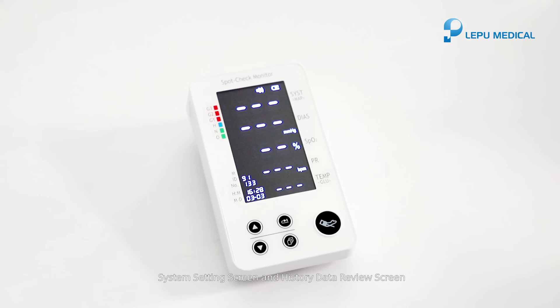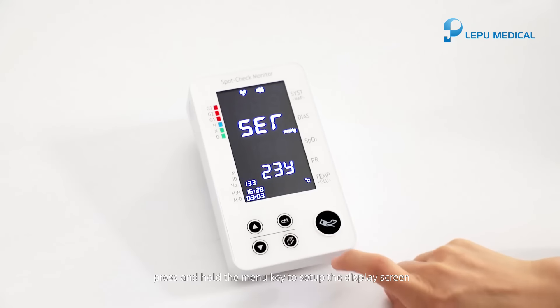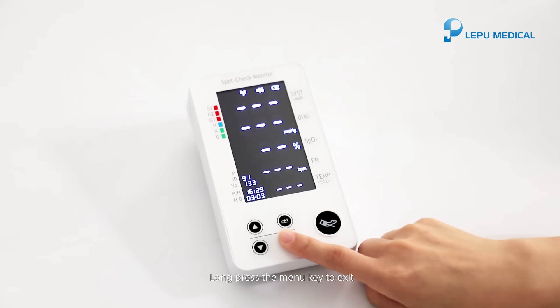System setting screen and history data review screen. On the measurement display screen, press and hold the menu key to set up the display screen. Settings include: the wireless function, pulse beep, blood pressure unit, temperature unit, date, time, and ID. Long press the menu key to exit.